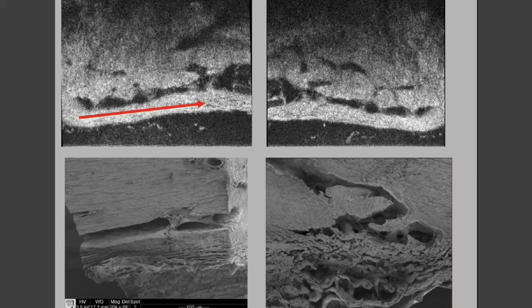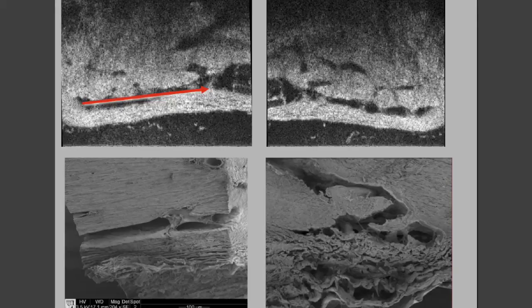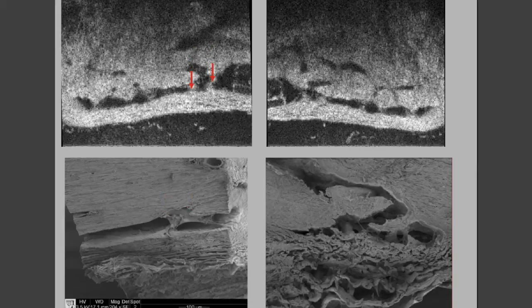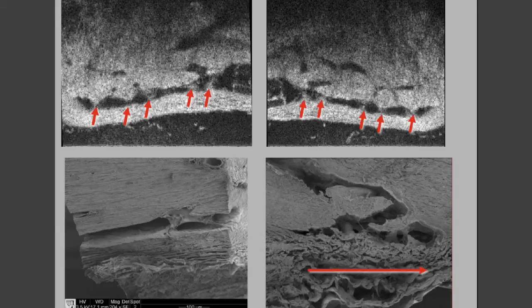An OCT image in a radial meridional section with the trabecular meshwork visible and scanning electron microscopy showing a similar image. Schlemm's canal, Schlemm's canal collector channel intrasclerally, are visible by both OCT and scanning electron microscopy. Hinged scleral flaps at collector channel entrances are visible by both OCT and SEM, and multiple cylindrical attachment structures between the trabecular meshwork and these collector channel entrances are seen in multiple images.